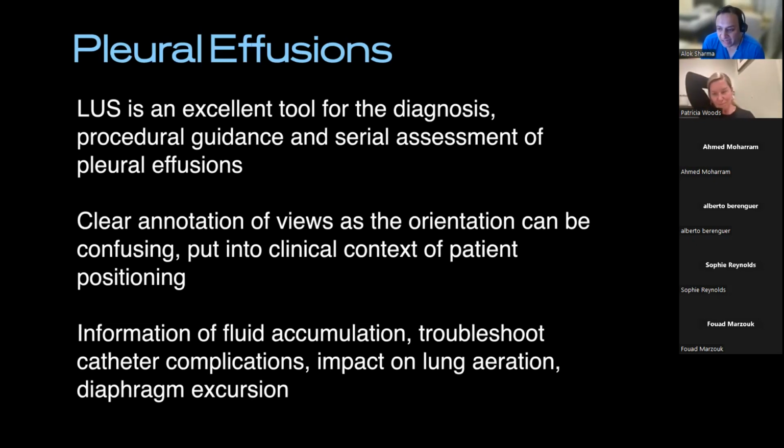I'm going to be honest to say, I don't think there are any studies of an actual formula in neonates. And the risk of extrapolating the adult data is that it might go against clinical correlation, because clearly that volume of fluid in an extremely preterm baby might have much more clinical impact compared to a term baby. So I agree. It's a very similar approach to measuring in centimeters from the lateral angle, and really the serial measurement, and before and after measurements if we're either tapping or putting a drain in that region, going inferiorly. So very similar to what you're doing, Trish.